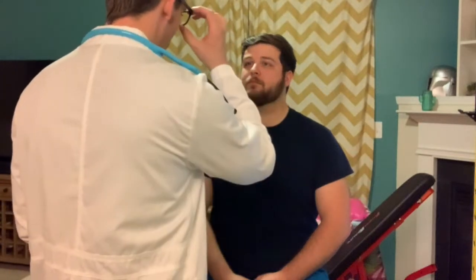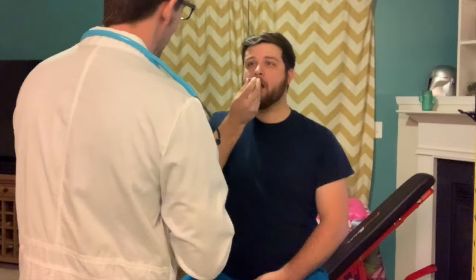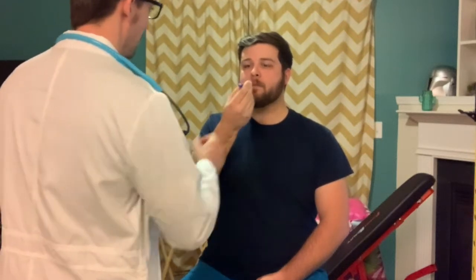Now, Mr. T, I'm going to go into an assessment of your vital signs, beginning with your temperature. Okay. If you could just hold this under your tongue, and when it beeps, you can give it back to me. While you're doing that, I'm going to count respirations. Temperature is 97.1, which is normal. Respirations, about 3 for a 15-second period, multiplied by 4, 12, so about 12 per minute. Normal is 12 to 20, no issue there.